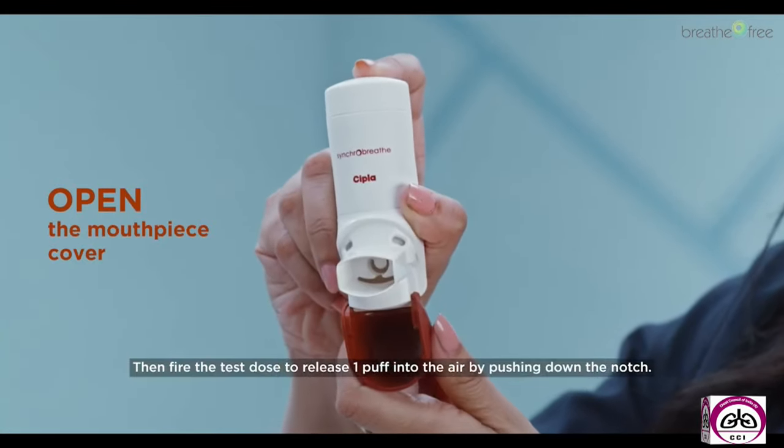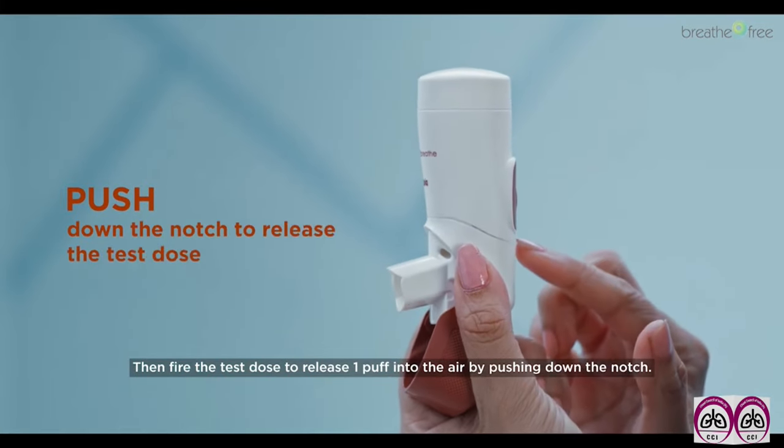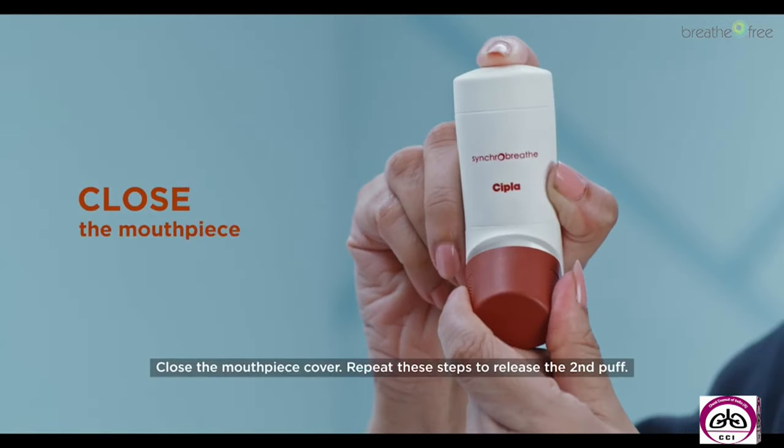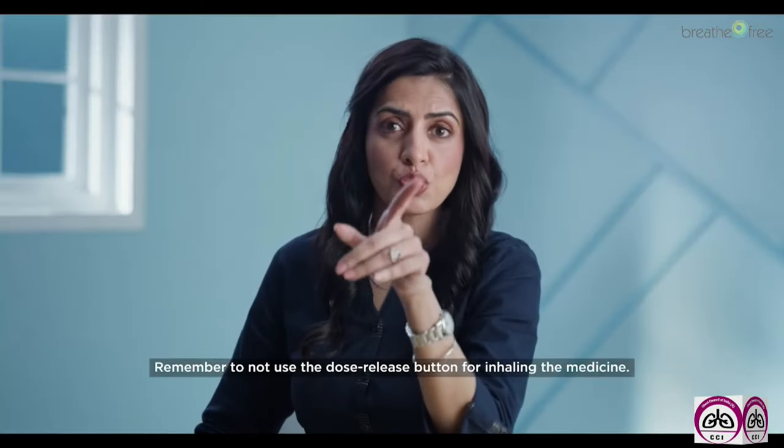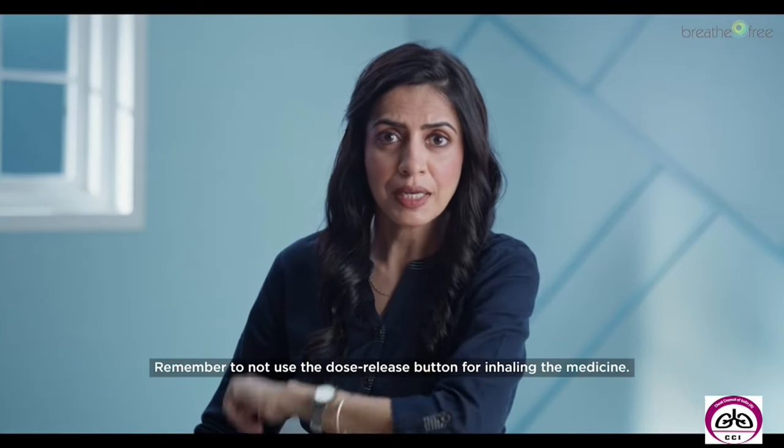Then fire the test dose to release the first puff into the air by pushing down the notch. Close the mouthpiece cover. Repeat these steps to release the second puff. And remember to not use the dose release button for inhaling the medicine.